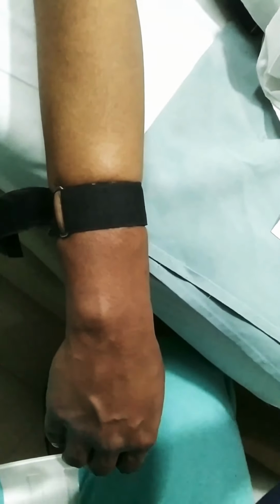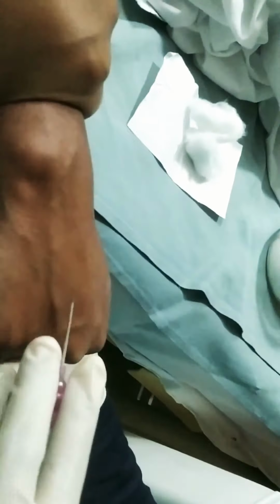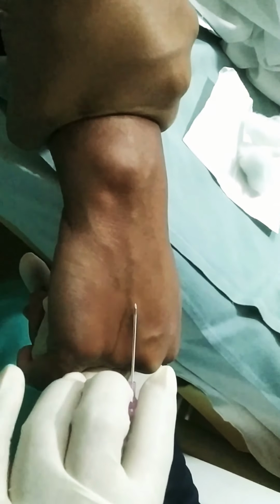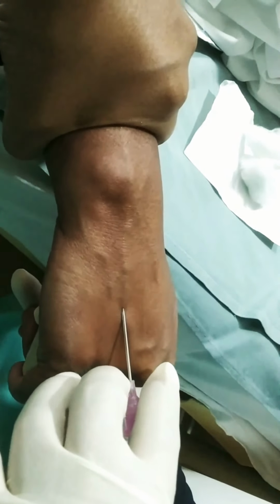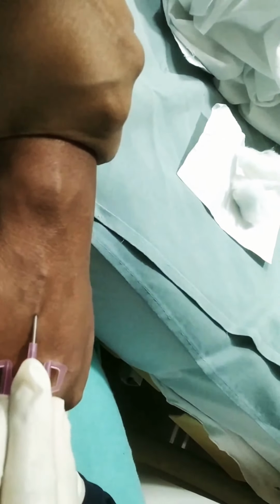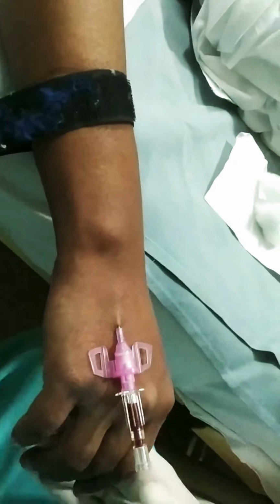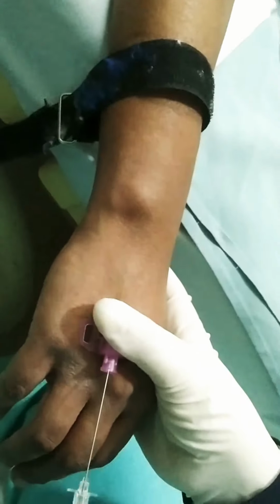Then insert the IV cannula at a 15-degree angle or a 45-degree angle to the selected vein. As my friend is using the 15-degree angle to insert the IV cannula, she slightly pulls upward and proceeds straight toward the vein, so that the needle will not puncture the vein or the medication will not infiltrate to the outer area of the vein.